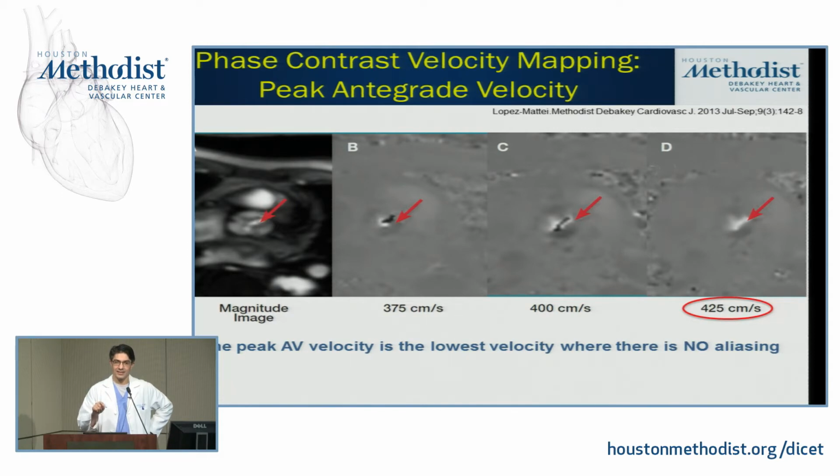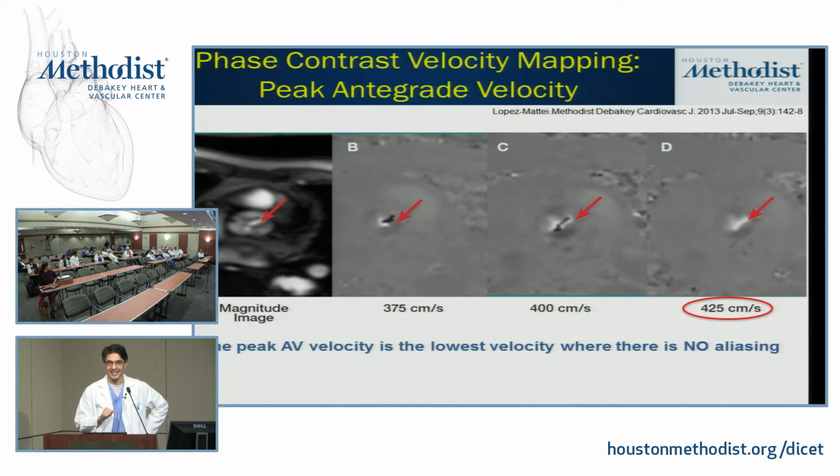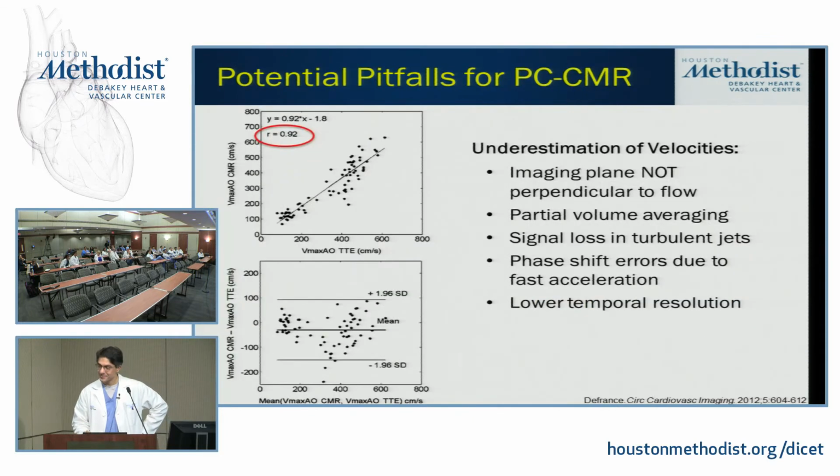Would it make more sense to actually say a range, rather than put a number that probably could be true, but maybe not? Yes. Maybe it's 415, 410? Yes. This is, Dr. Q, our fudge factor number 2. The truth is coming out. We report out the higher velocity, and the reason is... Can you start in your report as many fudge factors? Dr. Shah is going to be very upset when he reviews this on the video.